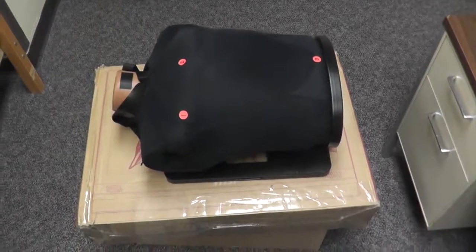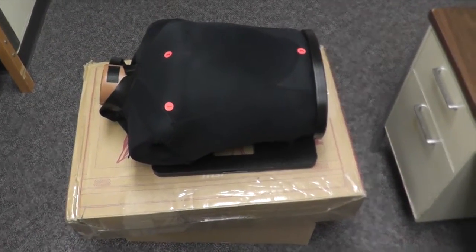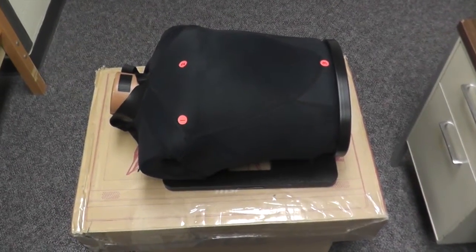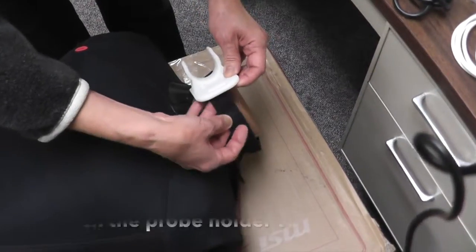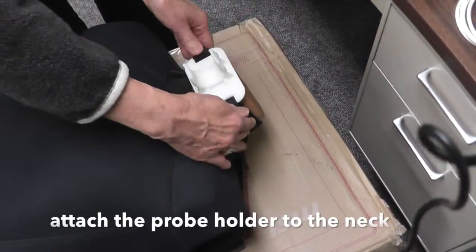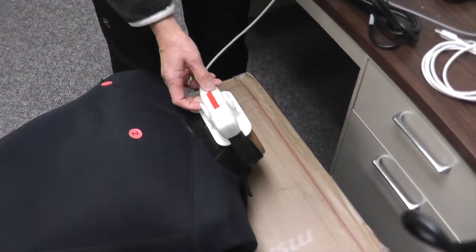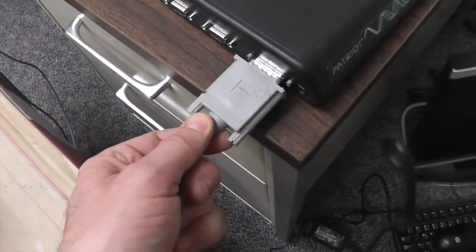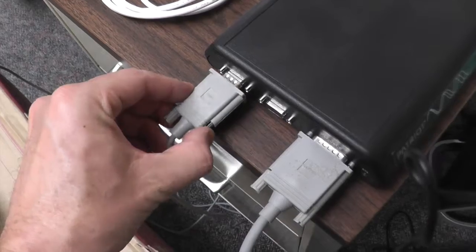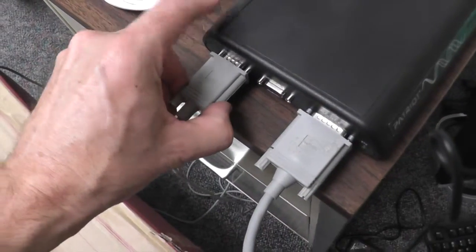Place the mannequin on top of the computer boxes. Keep it 1 foot away from anything metal so that there's not magnetic interference. Cable from the mannequin in here. Cable from the transducer in here, and secure.